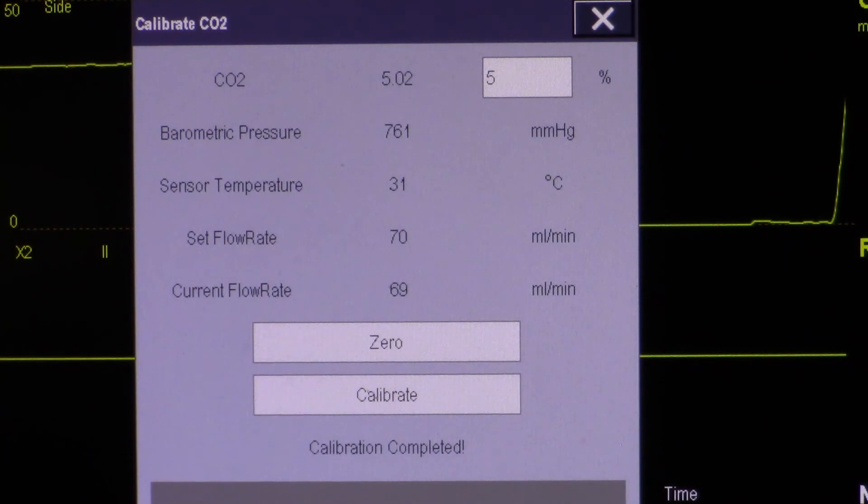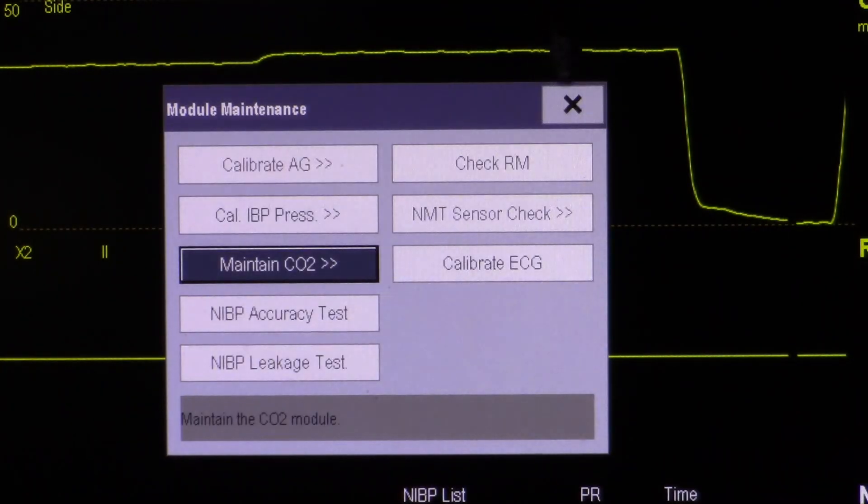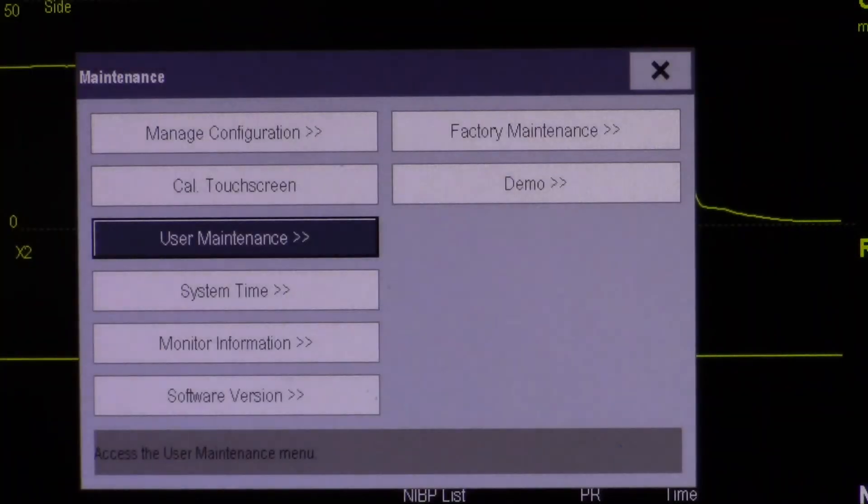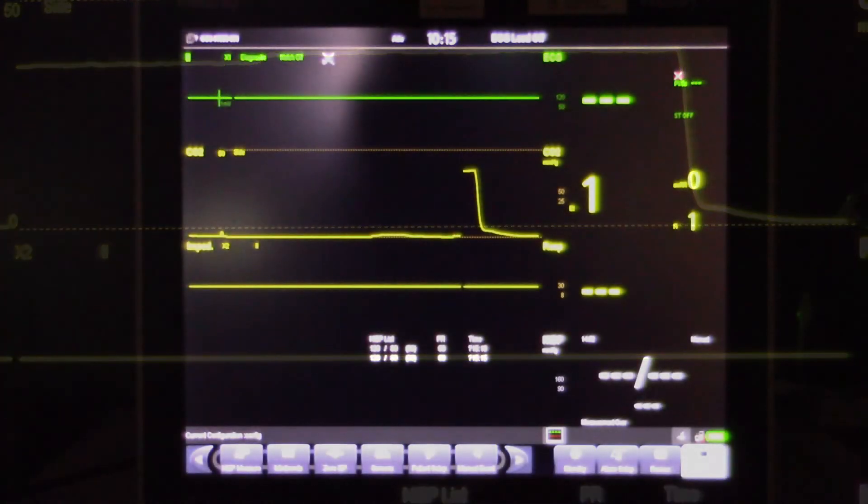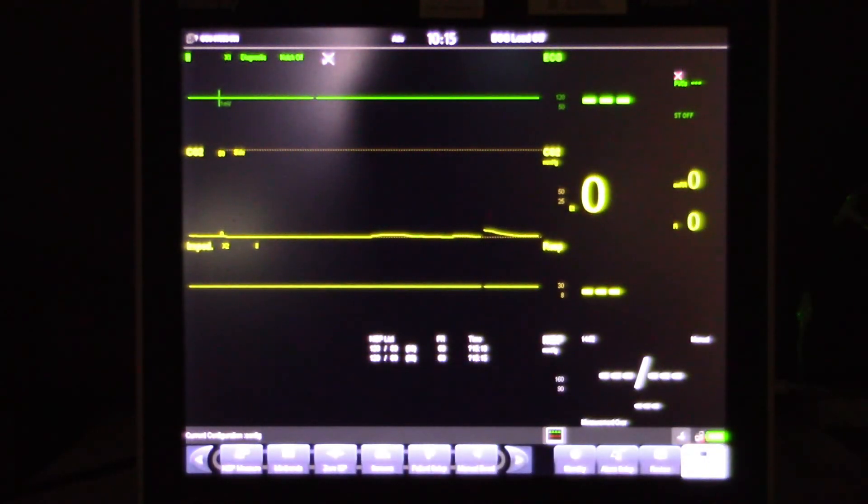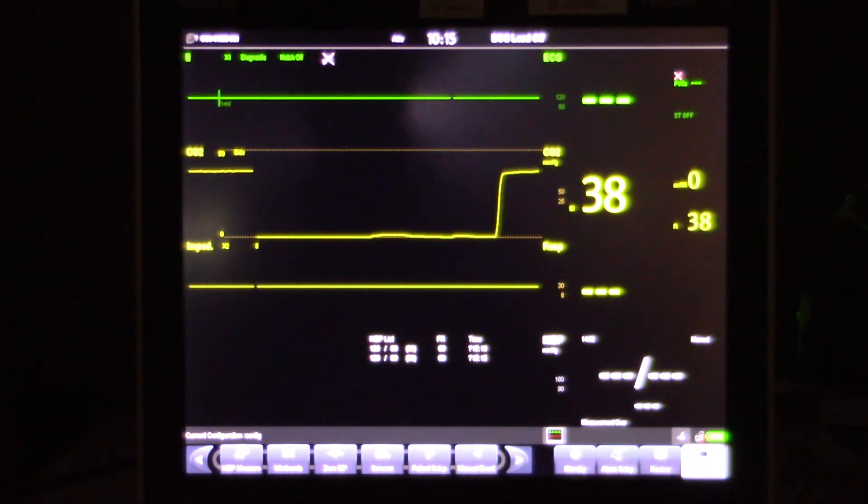Touch the X several times to close the windows and return to the main operating screen. In the normal operating mode, you can verify operational accuracy by applying the calibration gas again to confirm your reading is 38 plus or minus 2. Calibration was successful and accurate.